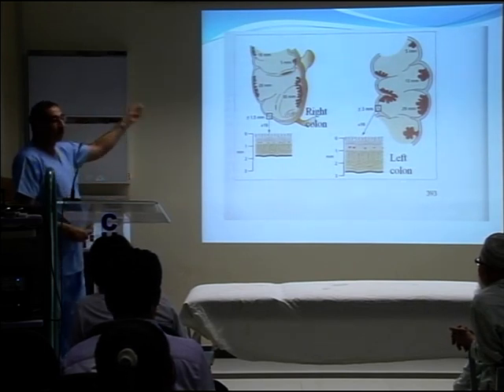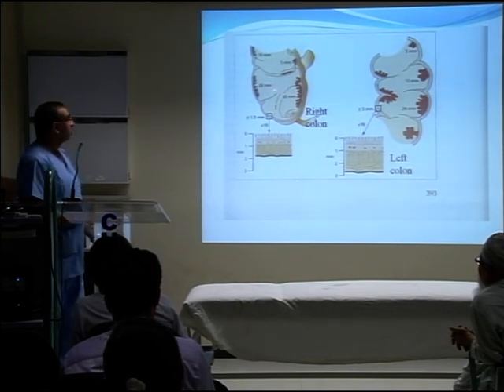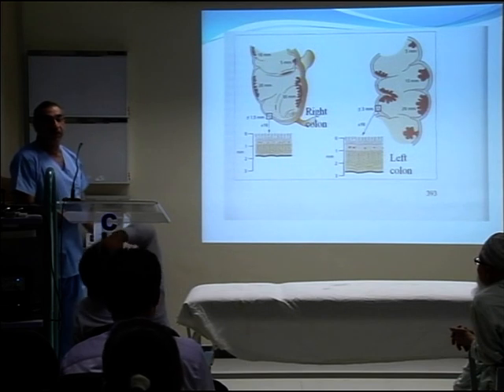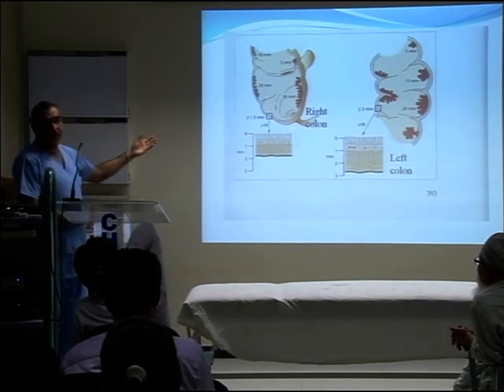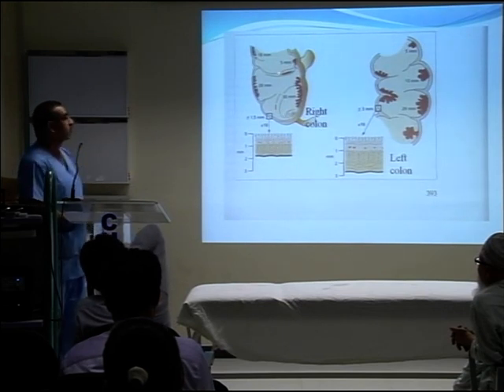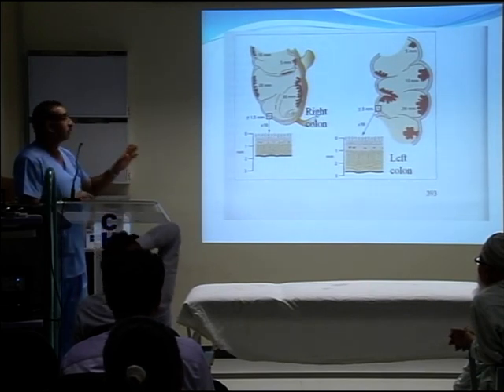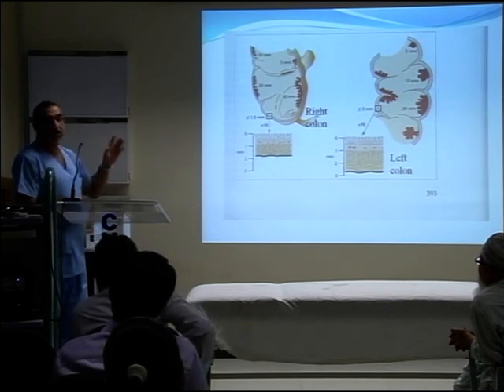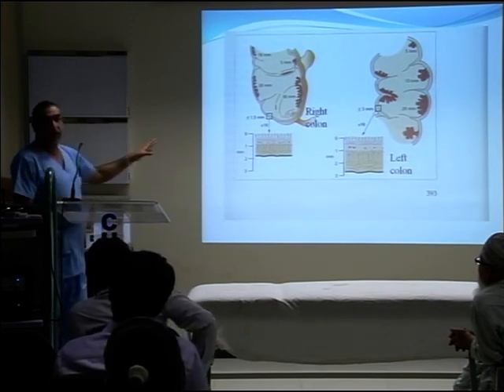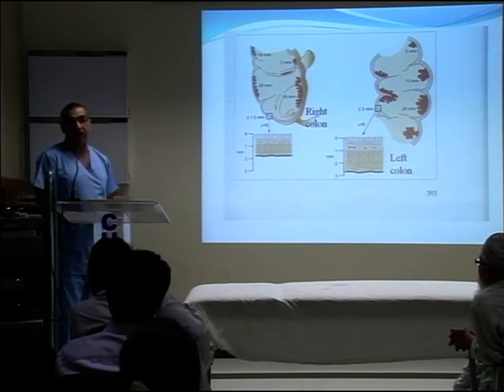Or you can just take a cold biopsy from it, because it's a real disgrace if you take a 2 mm polyp out and cause a perforation. That polyp might never cause any problems in future, and most of the time these polyps are hyperplastic. So be careful with using hot biopsy forceps. We never use it in our department, but if you are really pushed to use it, only use it on the left side. And again, those polyps can be very safely removed if they are less than 5 millimeters in diameter by simple cold snaring.